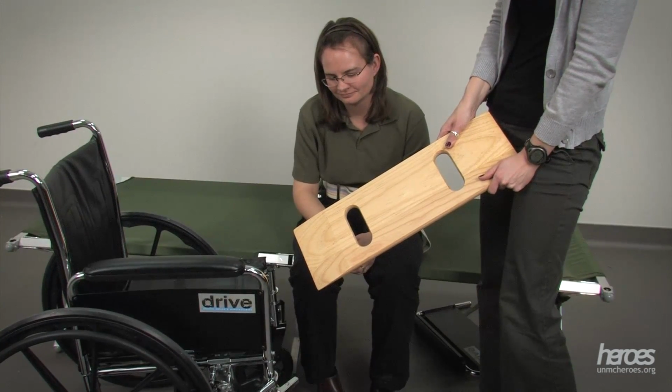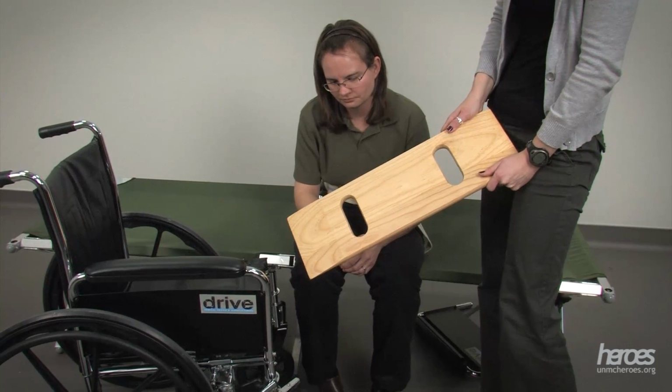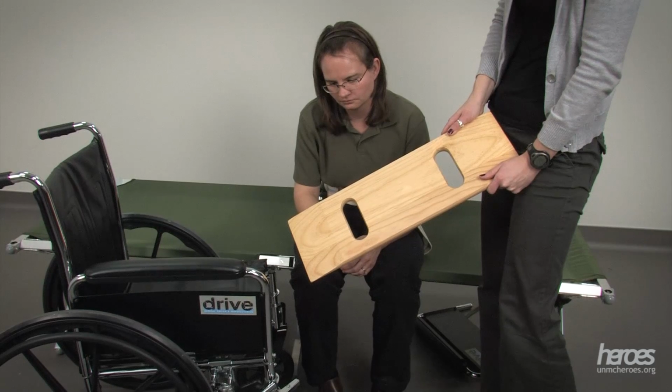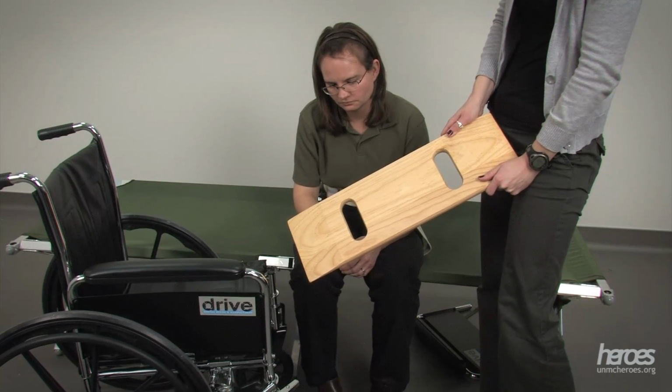Next, to help transfer the individual, a slide board will be used. This device can be used when an individual has a hard time standing up. The slide board can help an individual move from one surface to another without having to stand up.